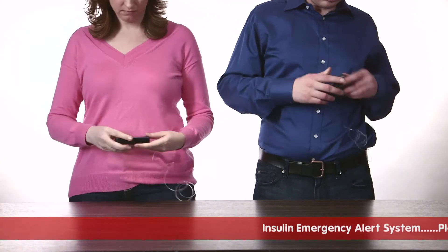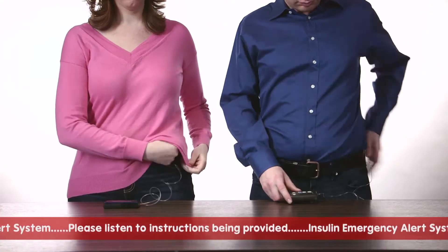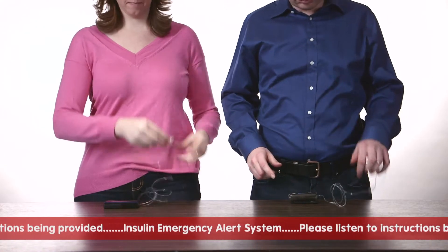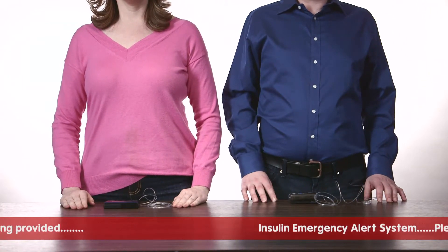Civil authorities in your area have detected two significant pump errors that have rendered the pumps unusable. Please remain calm. As this is highly unusual, we will guide you through the recovery process. Please follow the instructions.